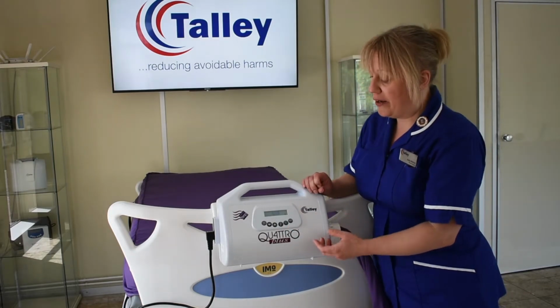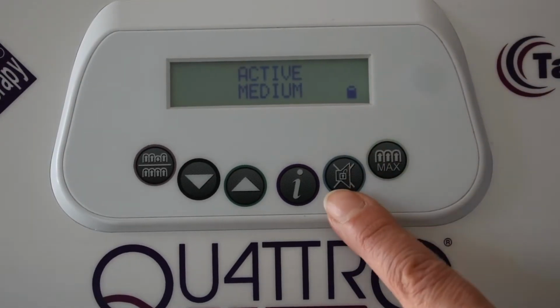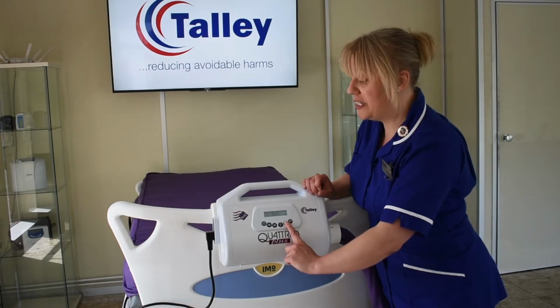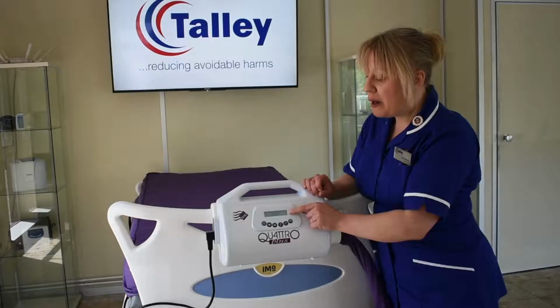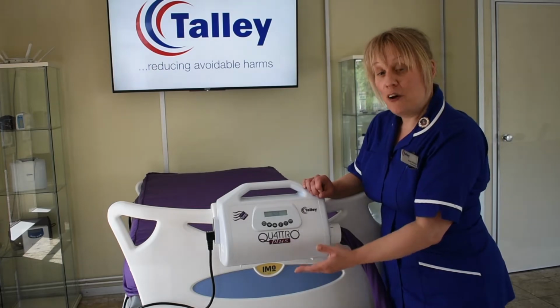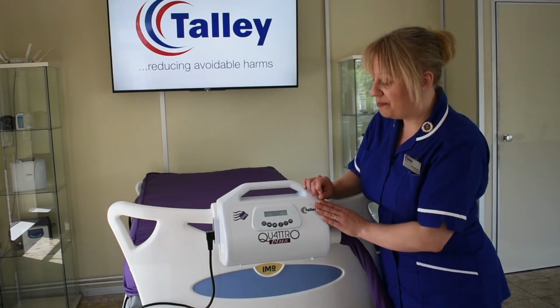So to unlock our power unit, we're going to locate the padlock and follow it down to the button directly below it, which is a dual function button. If we press and hold it down until it beeps, that will remove that padlock symbol and it unlocks your power unit. Once your power unit is unlocked, you can then use any of the buttons below to change settings and functions.